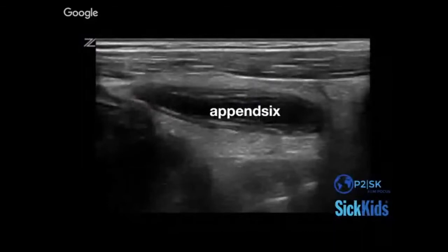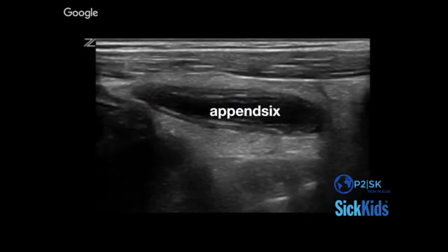Sometimes, if we're lucky, we can see the appendix draped on top of the iliac vessels and the diagnosis can be quite obvious. Here in longitudinal view we see an outer wall appendiceal diameter of more than six millimeters. A way to remember it: 'append-six' — six millimeters is the threshold for abnormal.